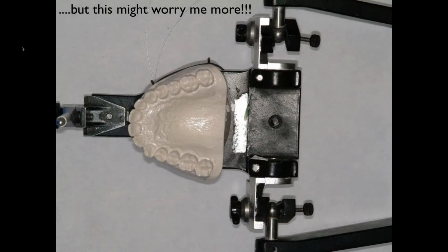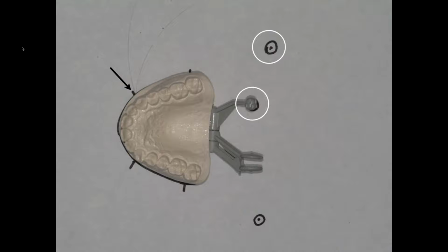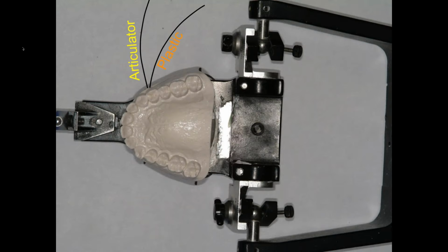But this one here, the lateral arc probably bothers me a little bit more when it comes to function. And so all I did was take an articulator and a plastic hinge articulator, mark the condyles, mark the cuspid, okay, and then draw the arcs with a compass from that cuspid and from that condylar position. And this is really interesting because this is exactly the opposite of what goes on when we talk about opening vertical on the hinge axis. Take a look at this. On the articulator, the teeth move almost directly sideways, whereas on a little plastic articulator, they move backwards very fast as they go sideways, all because of where the condyle is.